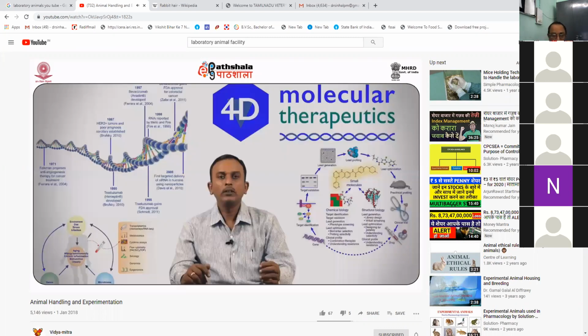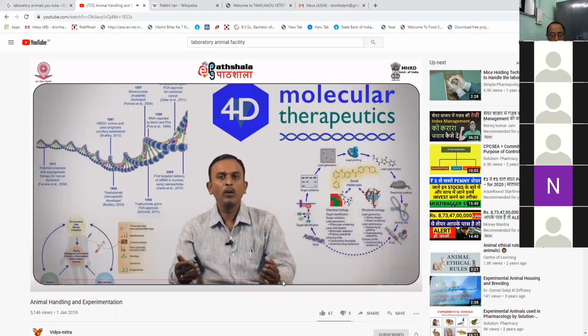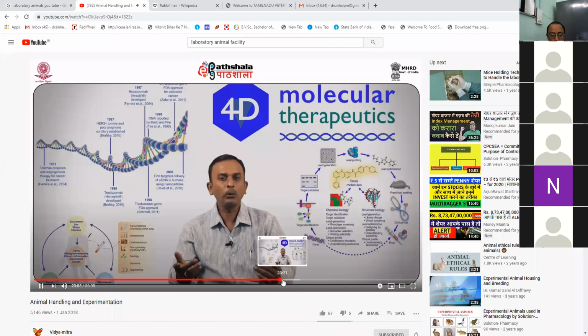Intravenous injections and blood collections. The following are the volume recommendations for acute intravenous fluid administration and blood collection in an adult mouse. An adult mouse weighs from 20 grams to 25 grams. And the safe intravenous injection volume, meaning injecting into the tail vein, is 0.2 ml.